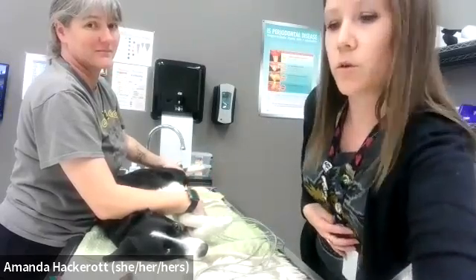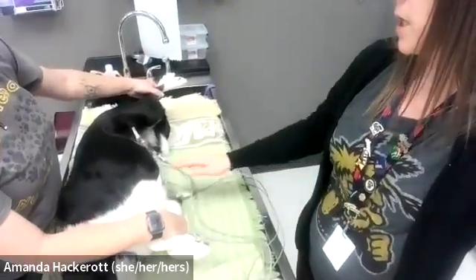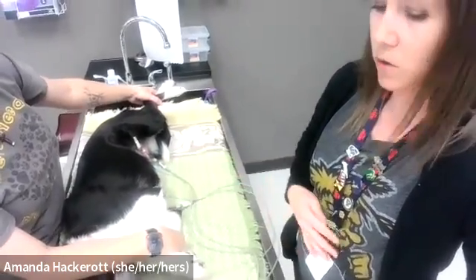You can see I have black and white on the axillary armpit, and I have red and green placed back here in the inguinal area.